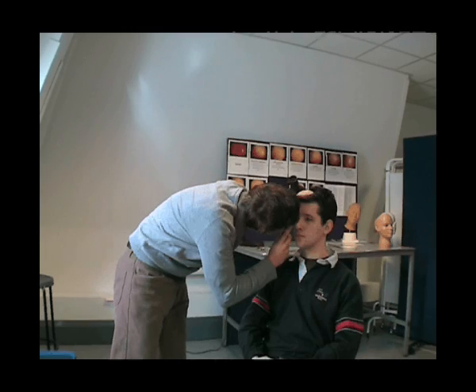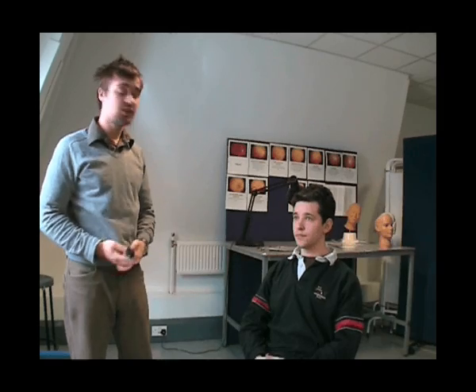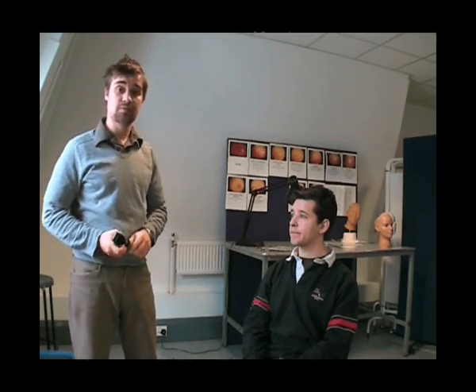Once I'm in the eye, I search for the optic disc. The optic disc is an area that appears as a white circle. If you can't find the optic disc, it's worth looking for blood vessels, because all the blood vessels trace back to the optic disc. You then look for any abnormalities of the optic disc itself — you may look at the colour, the size, and the borders.